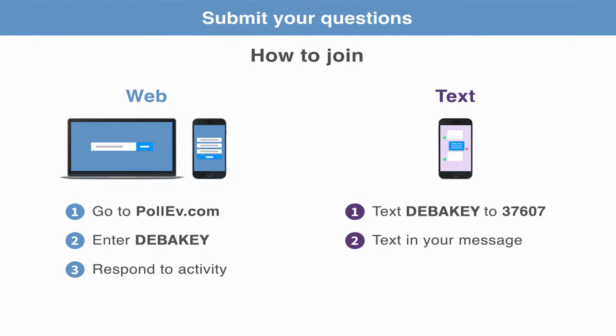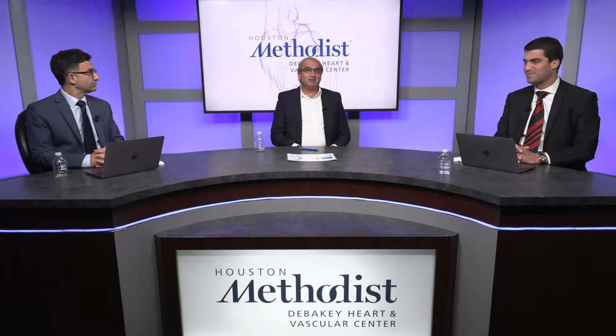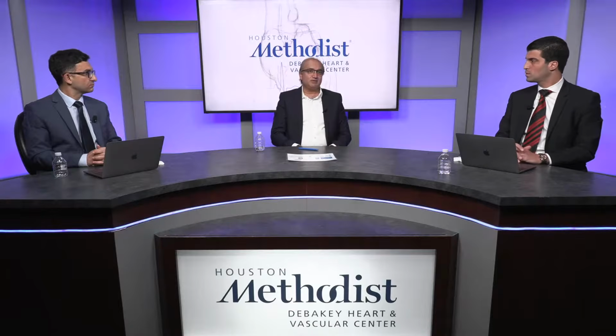And while we're waiting, George, I think this case is kind of a doozy. You've really got 3 different conditions going on in this patient. You've got apical HOCM, you've got an ASD, and then you've got pulmonary hypertension and atrial fibrillation. And one thing you pointed out, which is very important, is that if you're going to take a strategy of fixing the AFib and the ASD, you want to go after the AFib first, from a practical standpoint, because you can't cross the septum once you put an atrial septal occluder device.